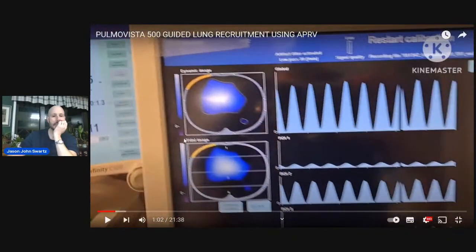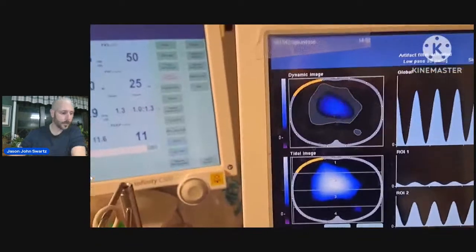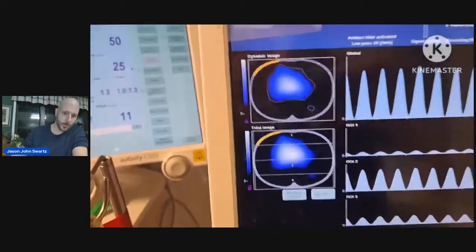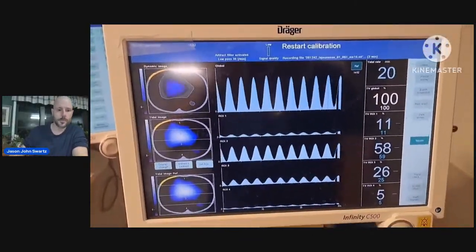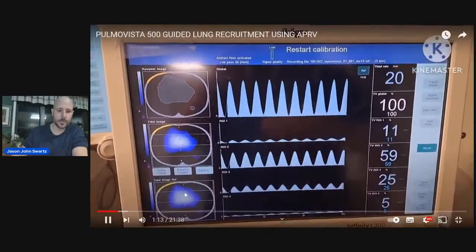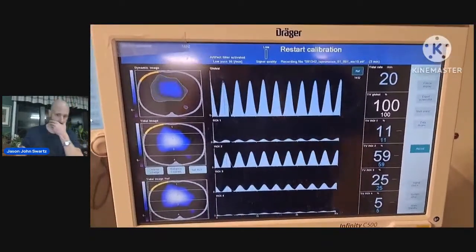Do you see that? See this circle? That circle is supposed to be here. All of this should have air. So this patient is not intubated for lung issues. And even the mid-dorsal region as well. So this will become a reference for us. The reference stays there. He's quite large. He has a very, very large abdomen.